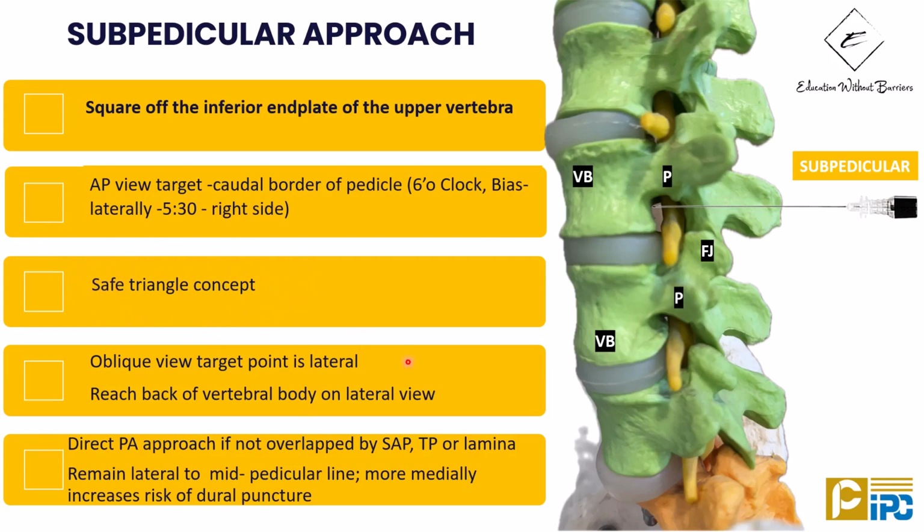Now, once you've achieved the right needle trajectory in the ipsilateral oblique view, which is the oblique of the C-arm towards you, to gauge the right depth, you go onto the lateral view and then you adjust the depth of the needle. Sometimes you don't even need to go oblique, especially in young patients when there are no osteophytes, the bony landmarks are very good and clear.